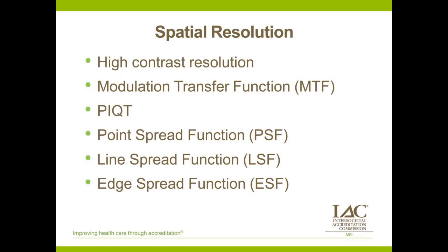And so I'm only pointing that out to say, if your scanner or your physicist or whomever is doing this for you has a very technical way of getting at one of these transfer or spread functions, and they're not doing spatial resolution using a phantom that has bars or dots in it, that's okay. They're still assessing the spatial resolution of the scanner when they do that.